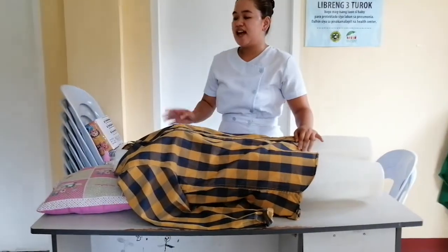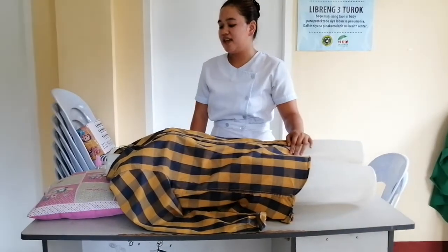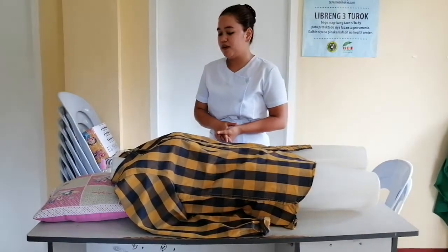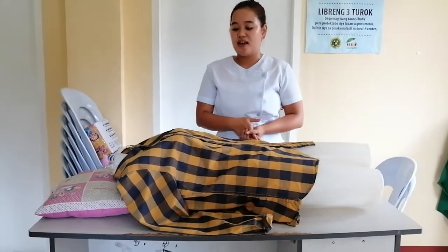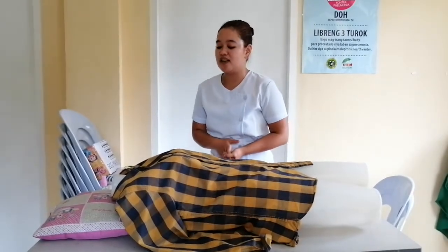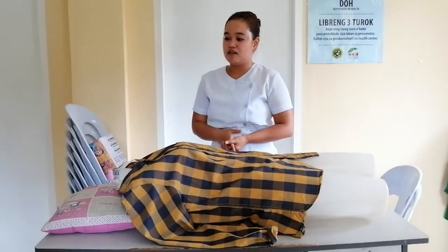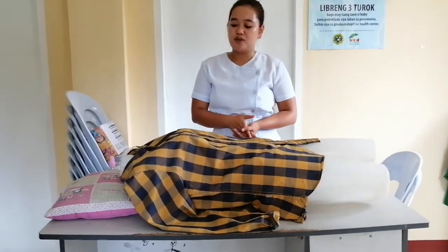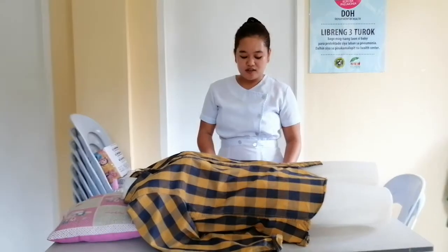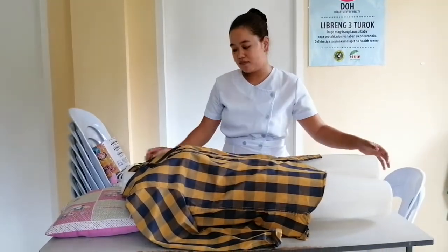After positioning the client, you need to instruct the client that as much as possible, stay still on the bed and refrain from talking during the procedure. Why is it important to instruct the client? Because talking or doing something during the procedure may interfere with the procedure that we are performing.